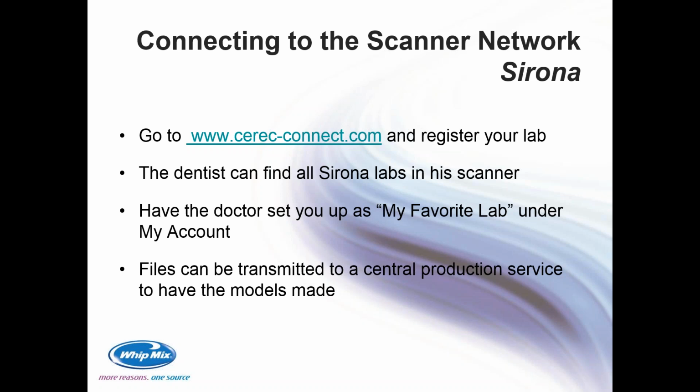And then files can be transmitted to a central production service to have models made if you were to try to stay in or felt the need to stay in the Sirona network, but that isn't necessary.